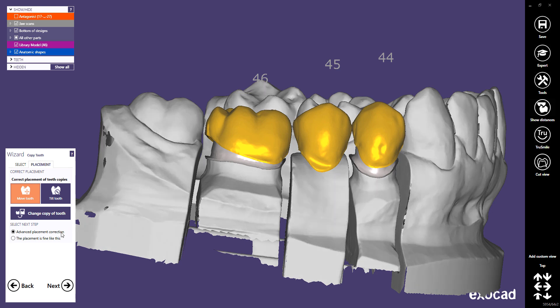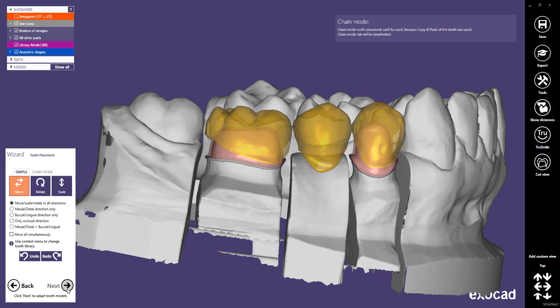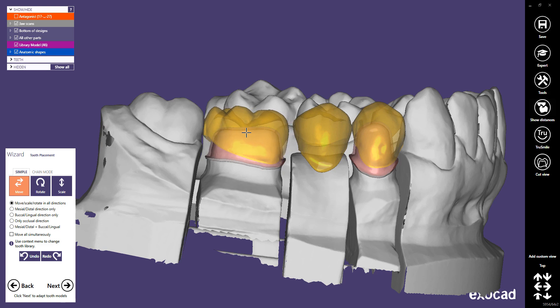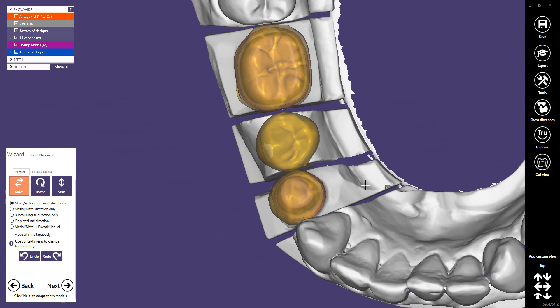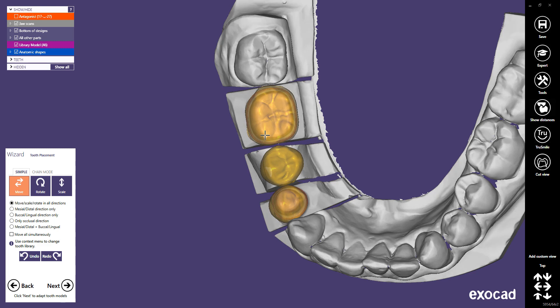Now you can select the next step. Advanced Placement Correction will open the known Tooth Placement dialog, allowing you to perform tooth placement again. Alternatively, select placement is fine like this and skip this step. You can then perform placement of the copied teeth as you know it from real library teeth, optimizing placement by moving, rotating, and scaling.